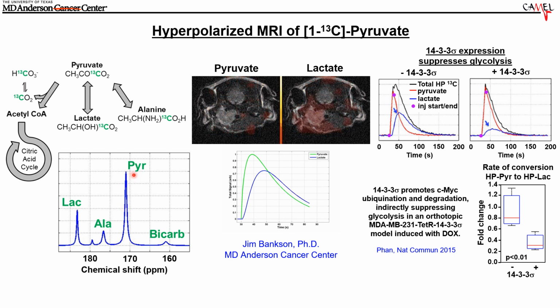And so by detecting different conversion rates, here's a case without a certain gene turned on so that the pyruvate to lactic acid transition occurred pretty quickly. Here, or without, I'm sorry, the gene was off. Here the gene is on, and you can see that destroyed largely the conversion rate of pyruvate to lactic acid. So you can start to see metabolic effects within the body.